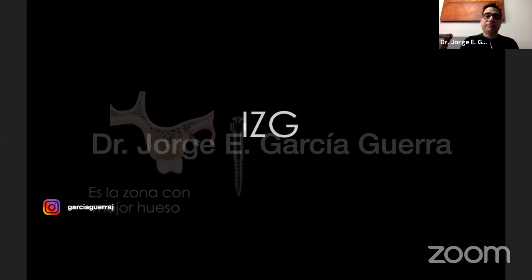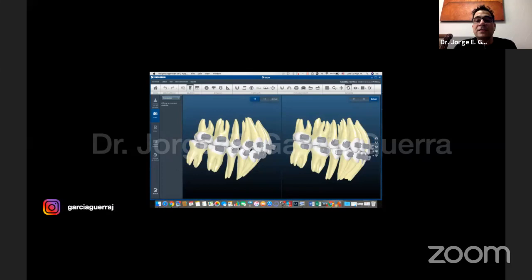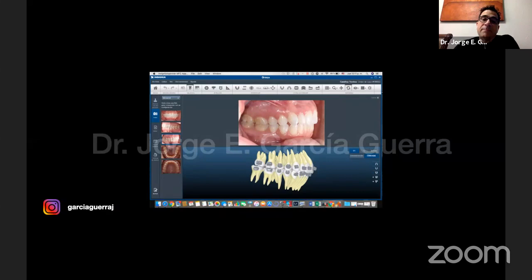Now, this is a case of a patient of mine. We're using here some self-ligating brackets, the Insignia from Ormco. At the planning, what we wanted to do was correct this excessive overjet that our patient had. In this case, she had very thin periodontal tissue in the lower segment, so what we're going to try to do is to distalize the upper segment so we can correct the class 2. The benefit of using this system is the bracket positioning and the torque compensation that we do on our cases. I don't do this in all of my cases, but it's a very good planning to do.